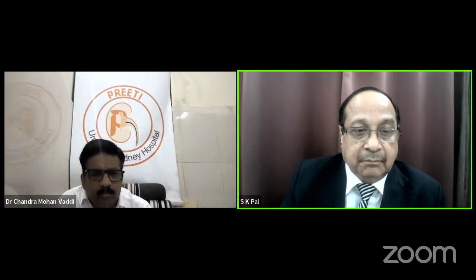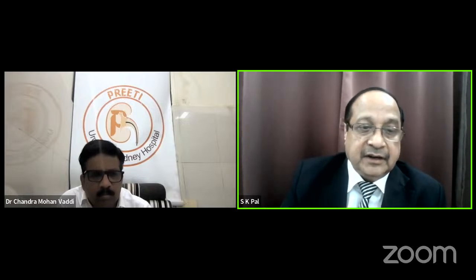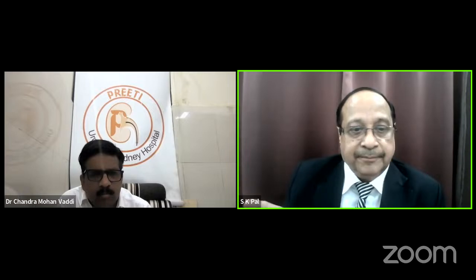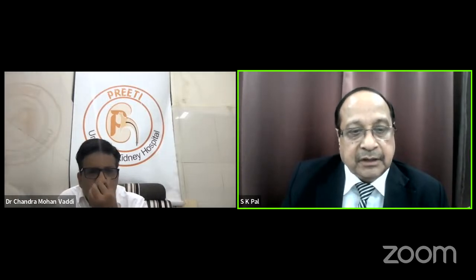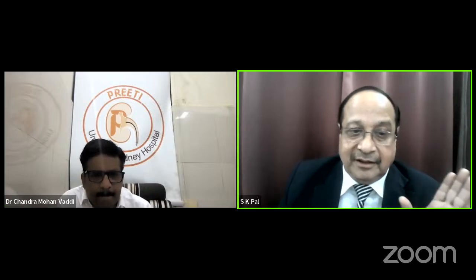But sometimes the upper calyceal infundibulum is at a very acute angle, more than 90 degrees. It is tortuous and you cannot enter there. Then definitely, if the stone fragment has gone from the pelvis to that calyx, it will come back also. In that case, I will make just a puncture in that calyx and flush very hard. So this stone, I have no need to go to the stone, it will come back. But if it is a stone which is already there, even then I will try flushing.